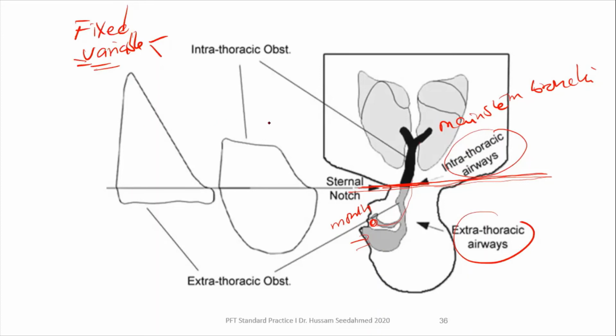طيب نجي للمعلومة بتاعت why this، يعني ليه أنا عملت الكيرف ده مقلوب. باختصار what's out is in. What is out is actually in. بمعنى extrathoracic airway lesions will affect the inspiration. What is out is in.